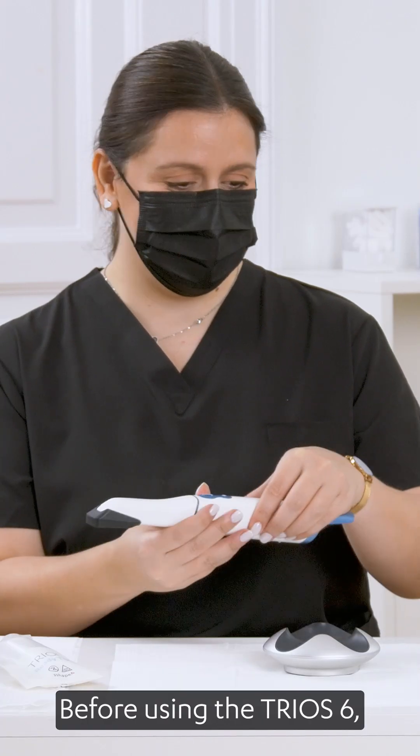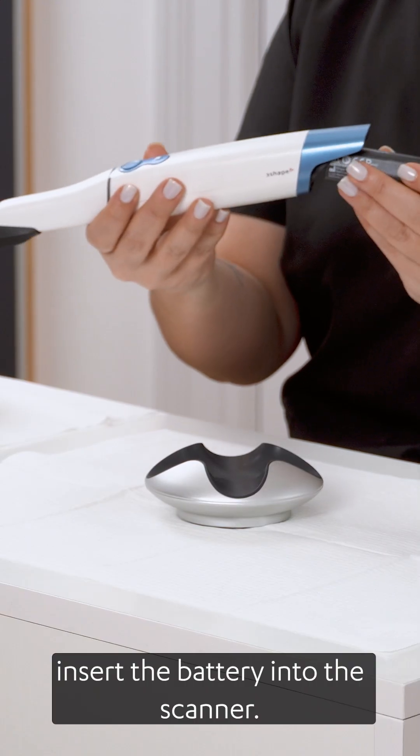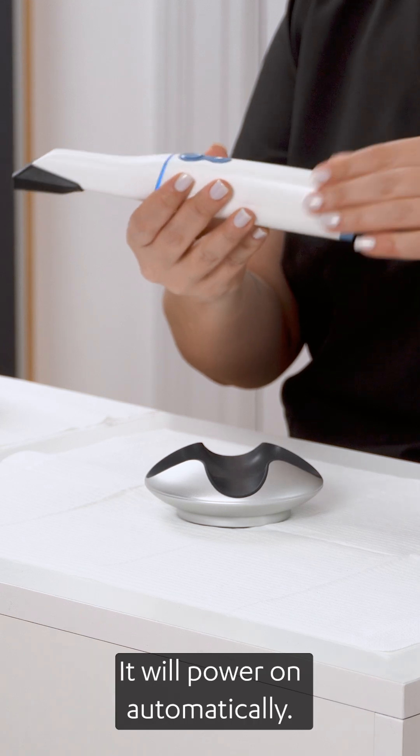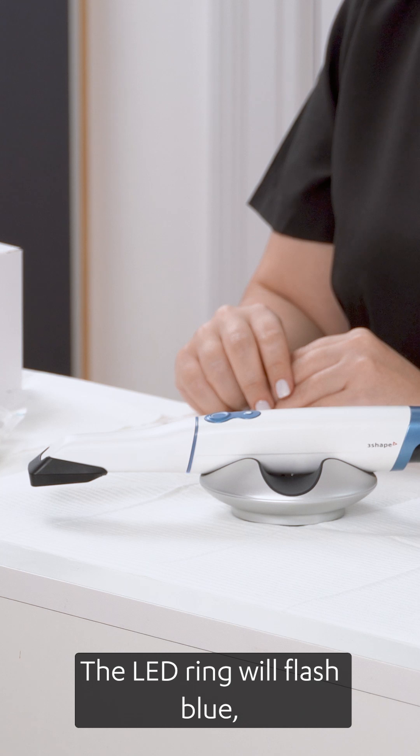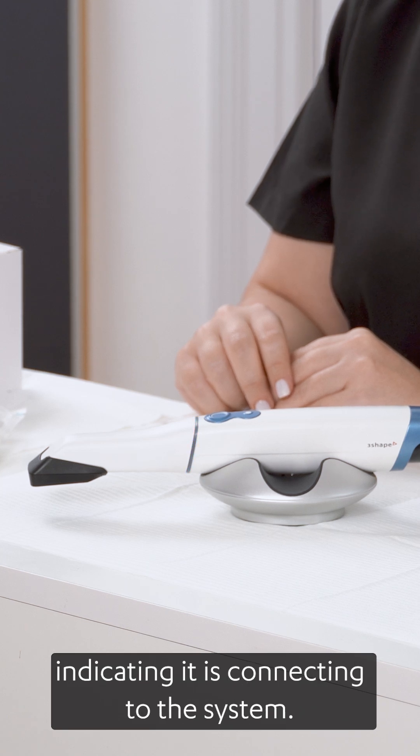Before using the TRIOS 6, insert the battery into the scanner. It will power on automatically. Now place the scanner on the pod. The LED ring will flash blue, indicating it is connecting to the system.